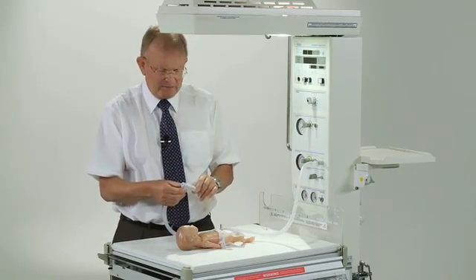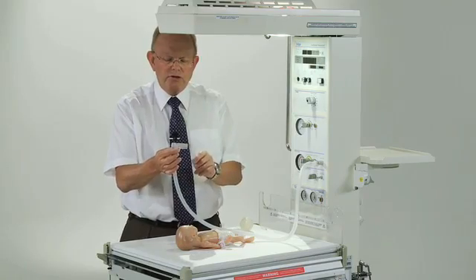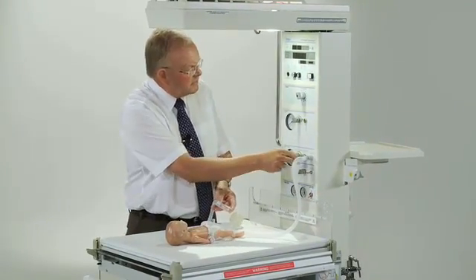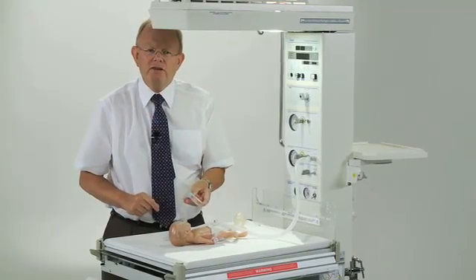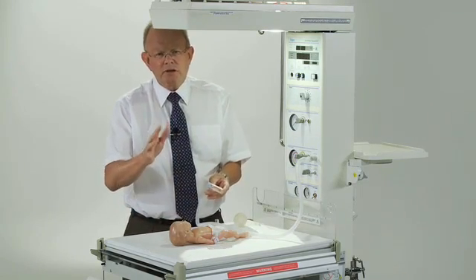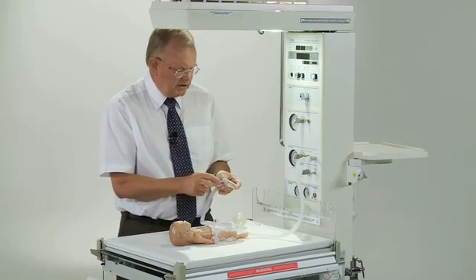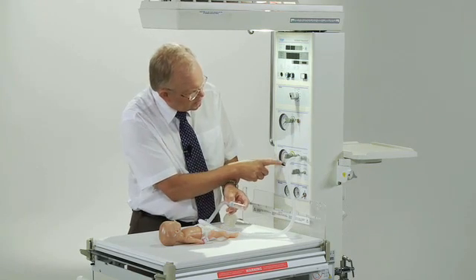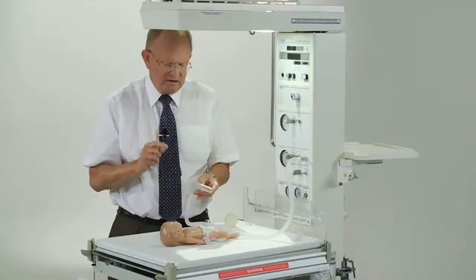In order to set it up, we first of all have the device with no mask or tube on it, and we obstruct the far end, turn on the flow, adjust that to 10 litres a minute, and now I'm going to set the PEEP pressure. I suggest you set a PEEP pressure of somewhere just above 5 centimetres of water — 6, 7 — but no less than 5. By looking at this dial here, I turn the knob in order to make sure I've got the pressure I want, and I've set it to 6 centimetres. So that's set the PEEP pressure.